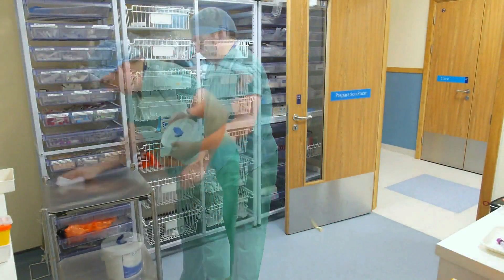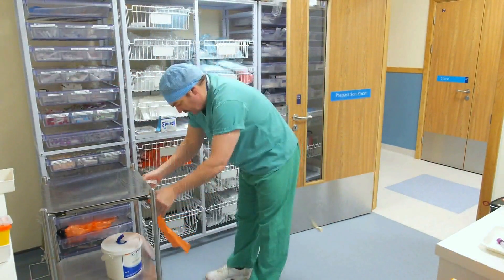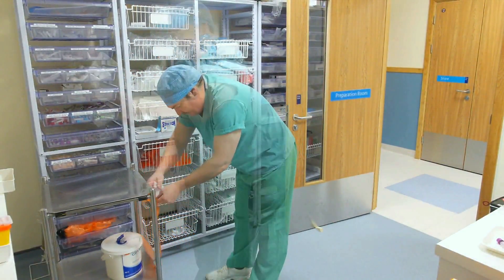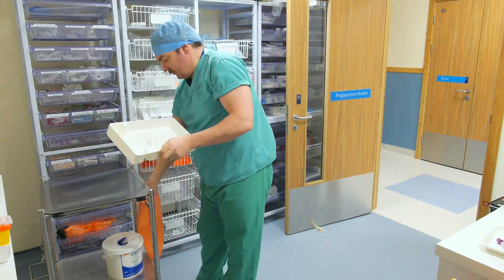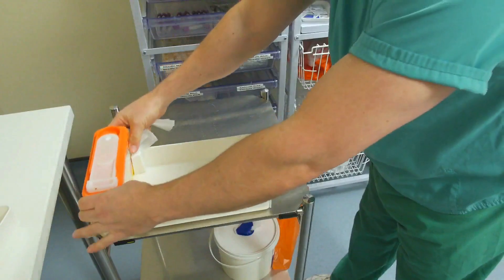Prepare a trolley and ensure all surfaces are clinically clean using a detergent wipe. Attach a disposal bag and make sure you thoroughly clean the collection tray surfaces and underneath the sharps box.